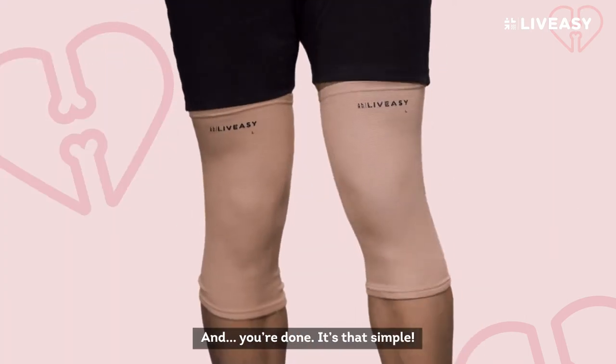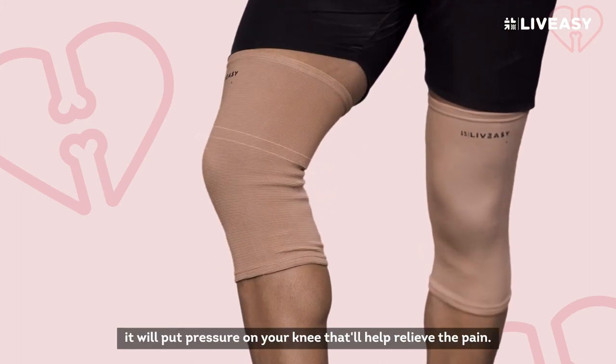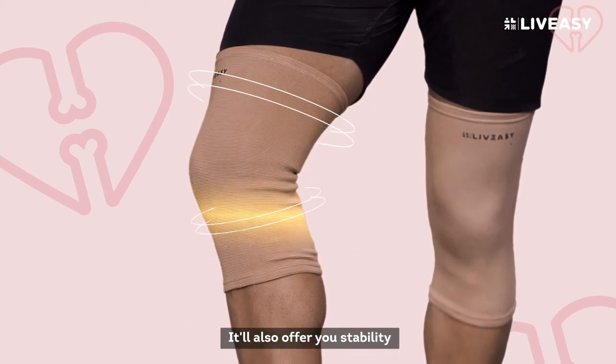And you're done! It's that simple! Once the LiveEasy kneecap is on and secure, it will put pressure on your knee that'll help relieve the pain. It'll also offer you stability.